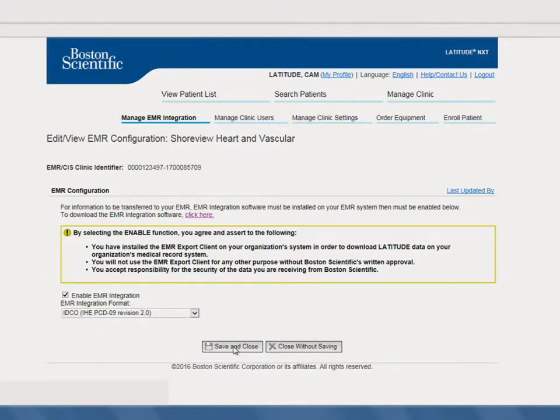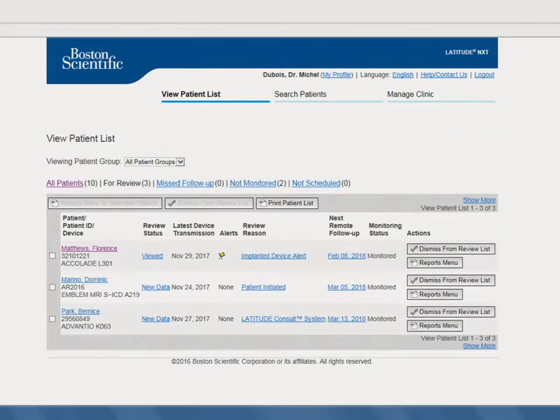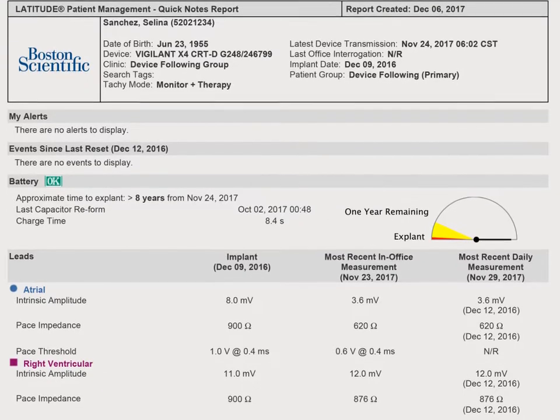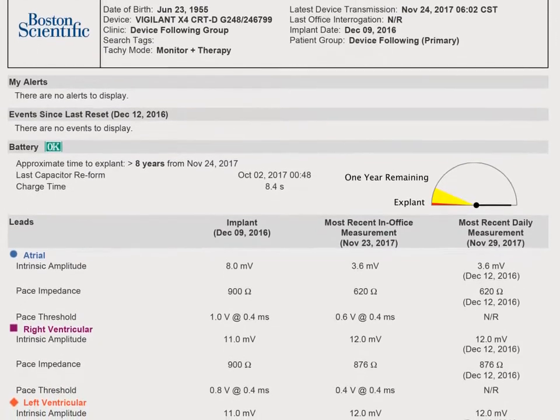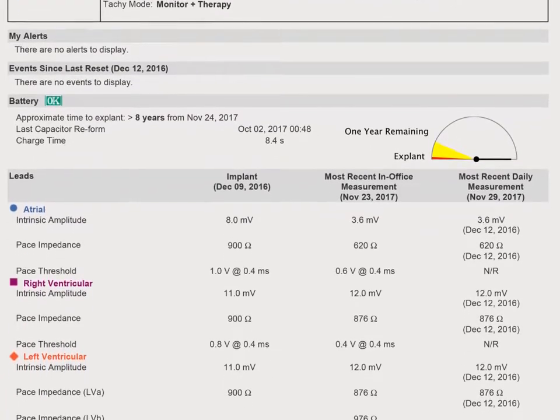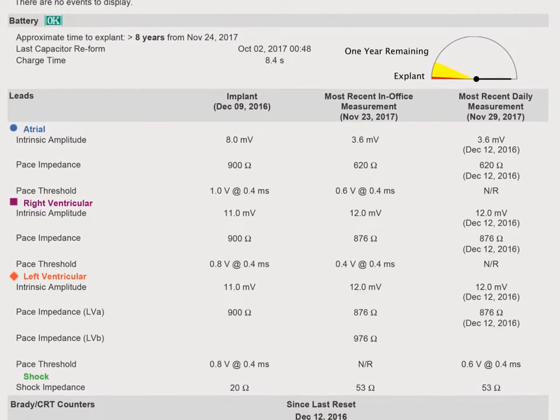Once you've successfully set up your EMR integration, applicable data will flow automatically from Latitude Next to the EMR as new information arrives on the View Patient list. The summary information sent to the EMR is based on the Quick Notes report. Data is sent to the EMR when a transmission is received from the patient's communicator and posted on the For Review filter on the View Patient List page.